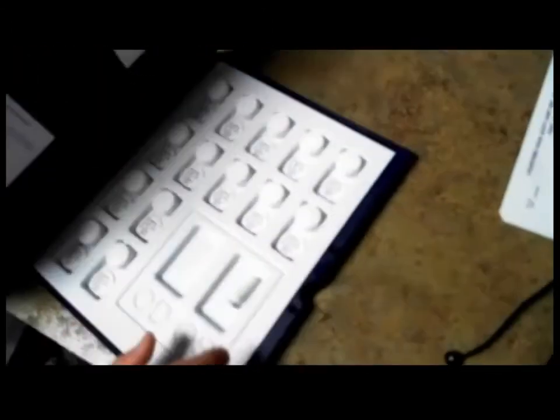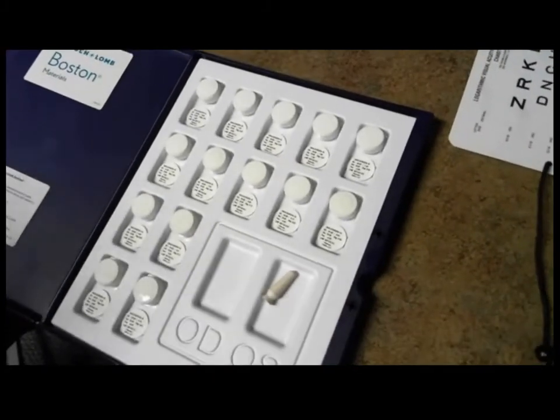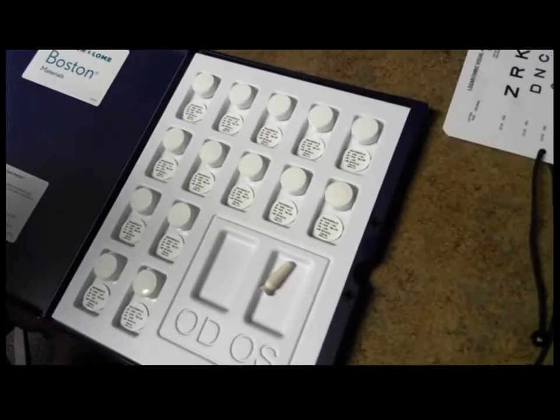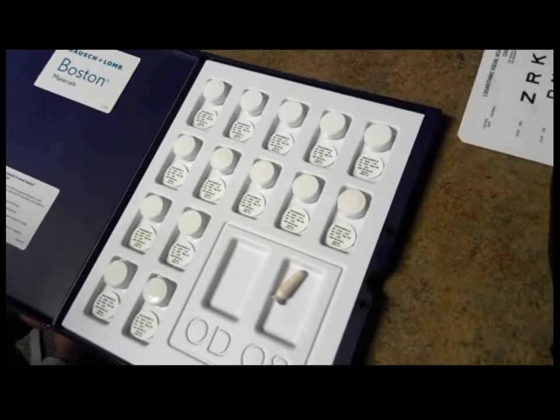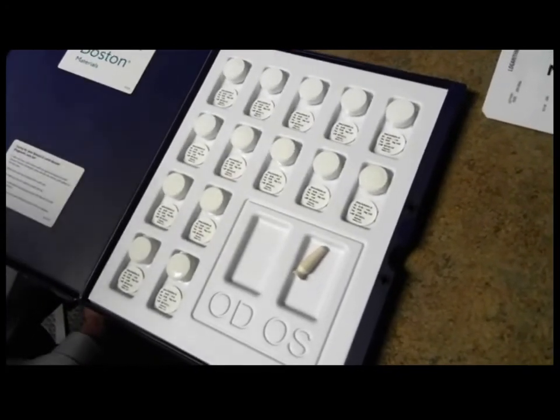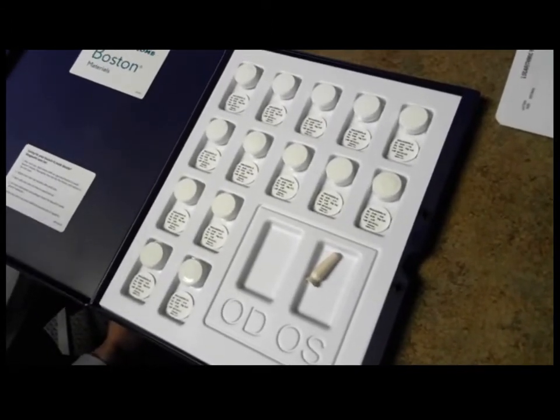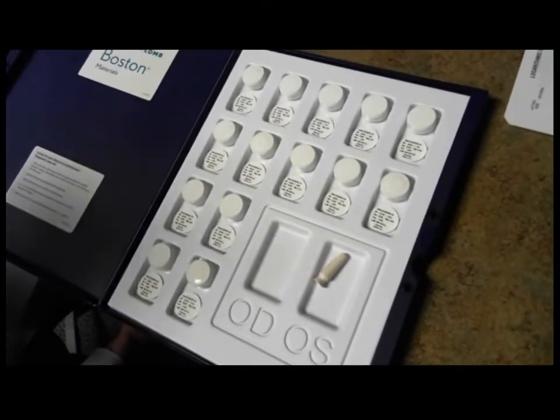We're going to open the book. And I like to start out with the larger diameters first. So we have actually two diagnostic fitting sets. We have an 18.0 diameter set, and we also have a 16.0 diameter set. And that will give you more ability to tune the diameter for what your patient's needs are.